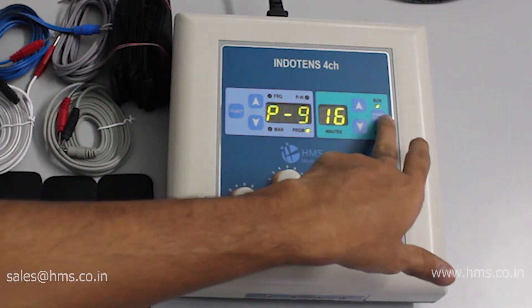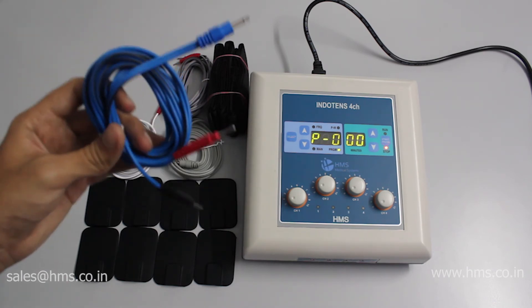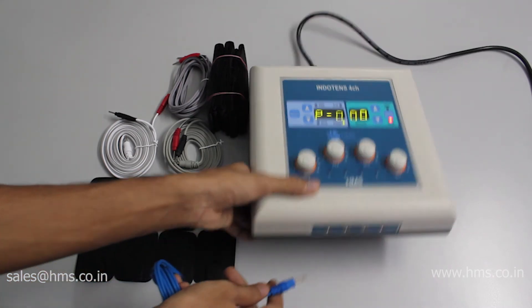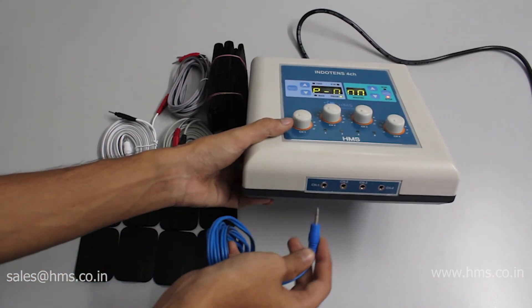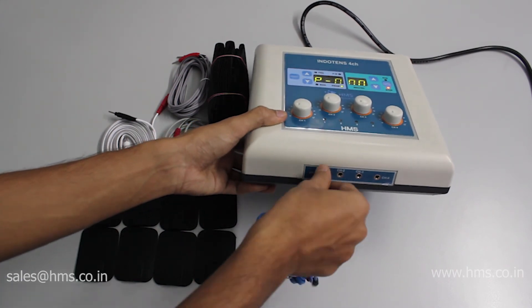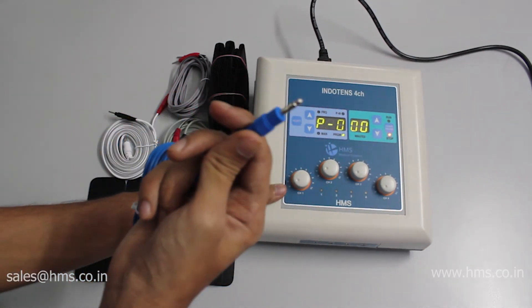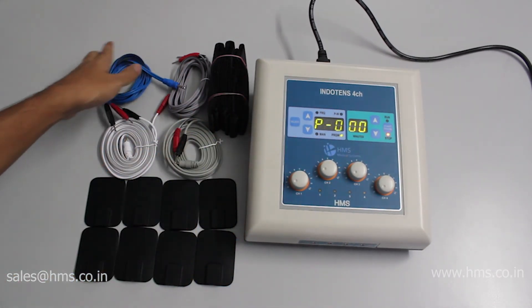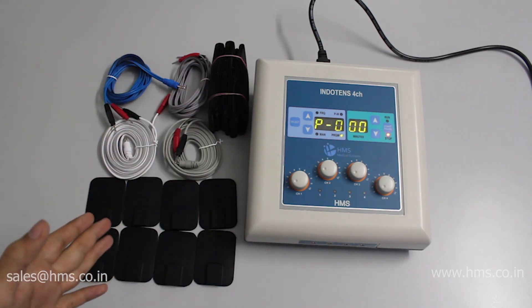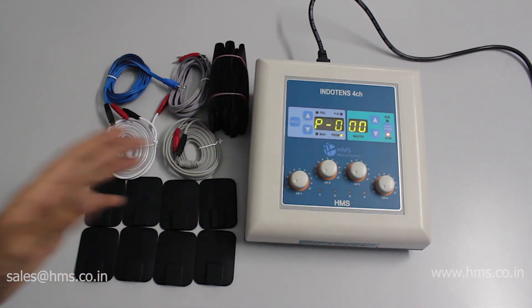The device is very simple to use. Plugging in the cable is also easy — it's just a single cable per channel, so you don't need to plug in separate positive and negative cables. It's just like an aux pin on your smartphone. Overall, the Indotense 4CH is a very simple and basic TENS model that contains all the essential features required.